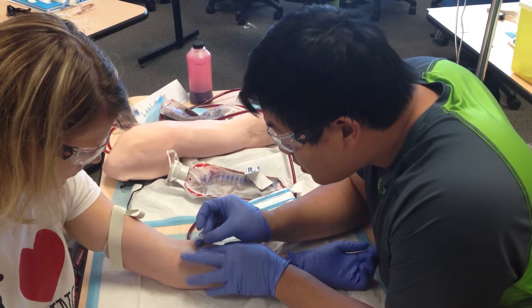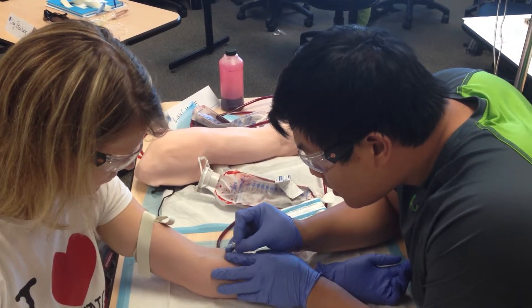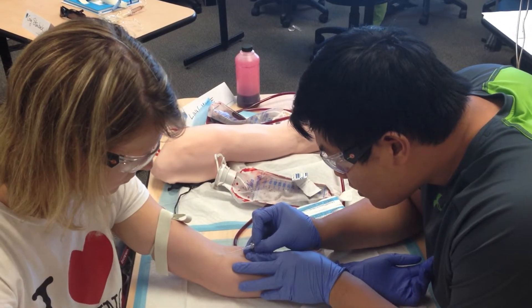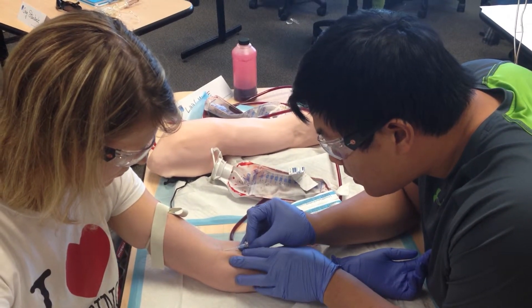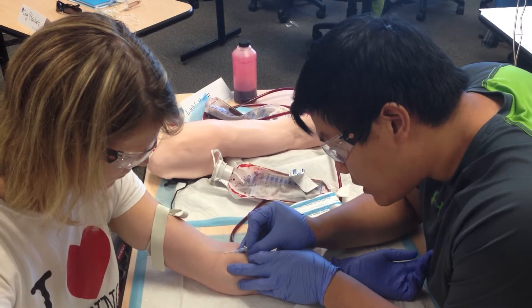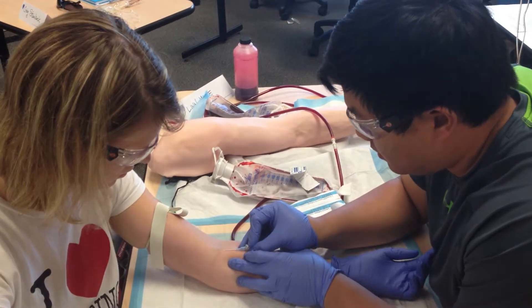Watch that finger anchor lower. I would start a little bit lower so that you can aim for that spot. There you go. You missed it? So don't take it out — just thread it into the right hand side.